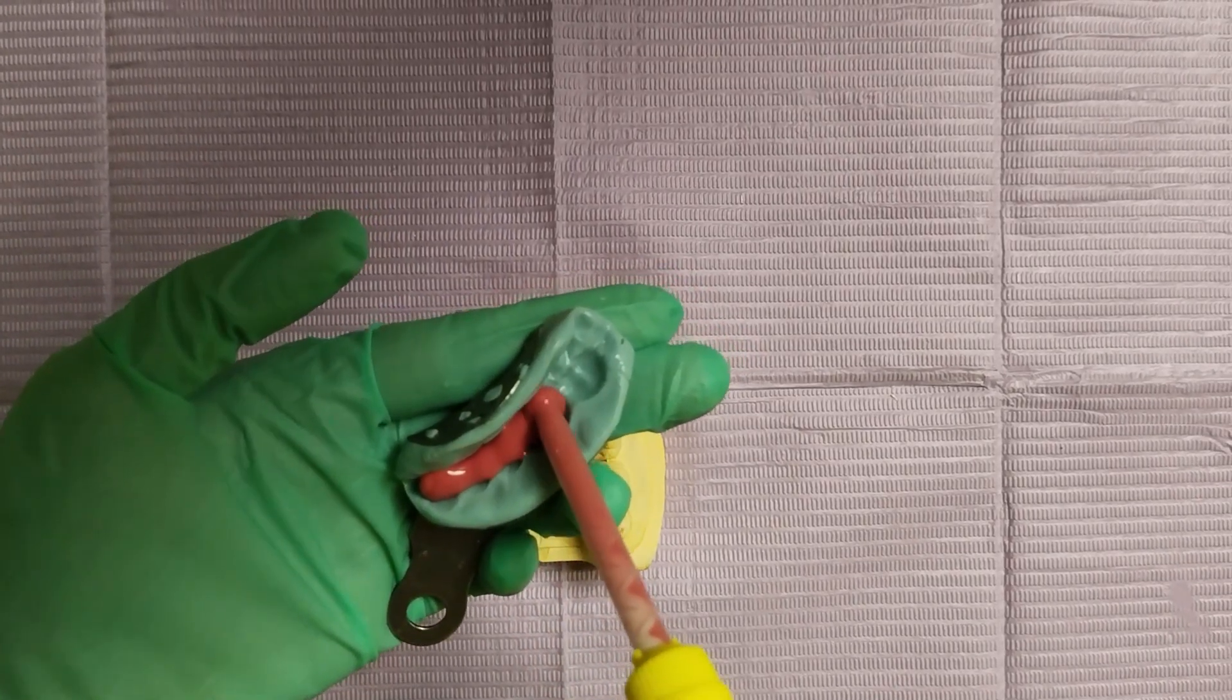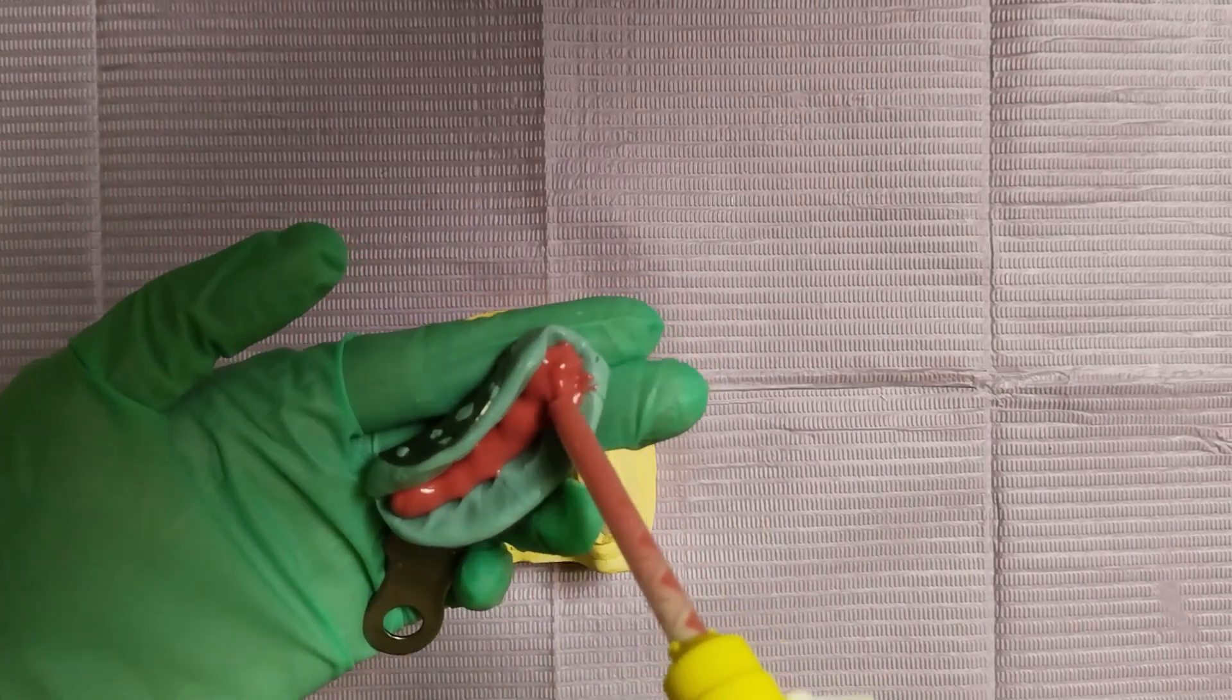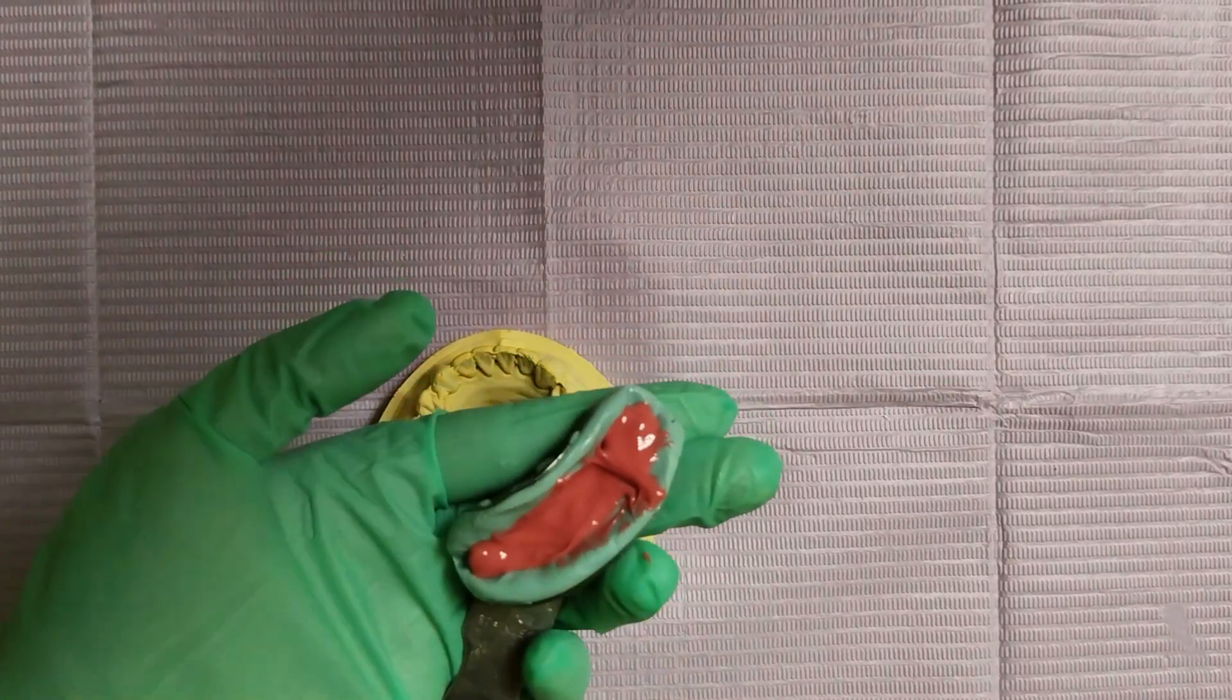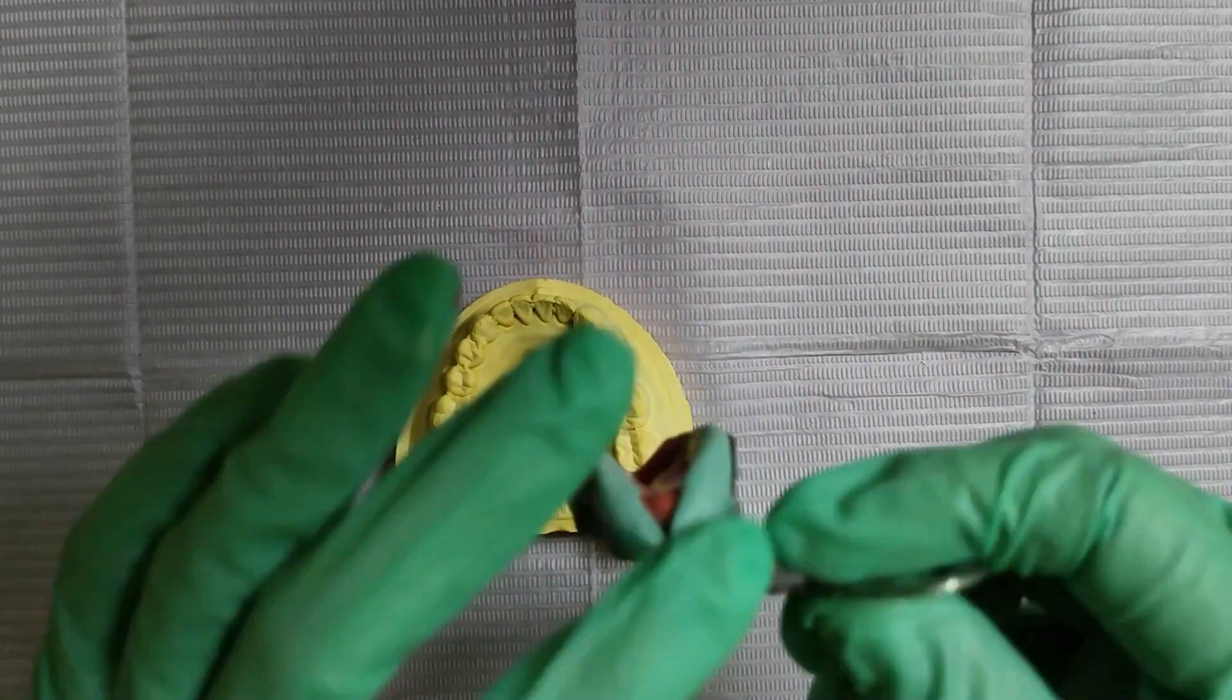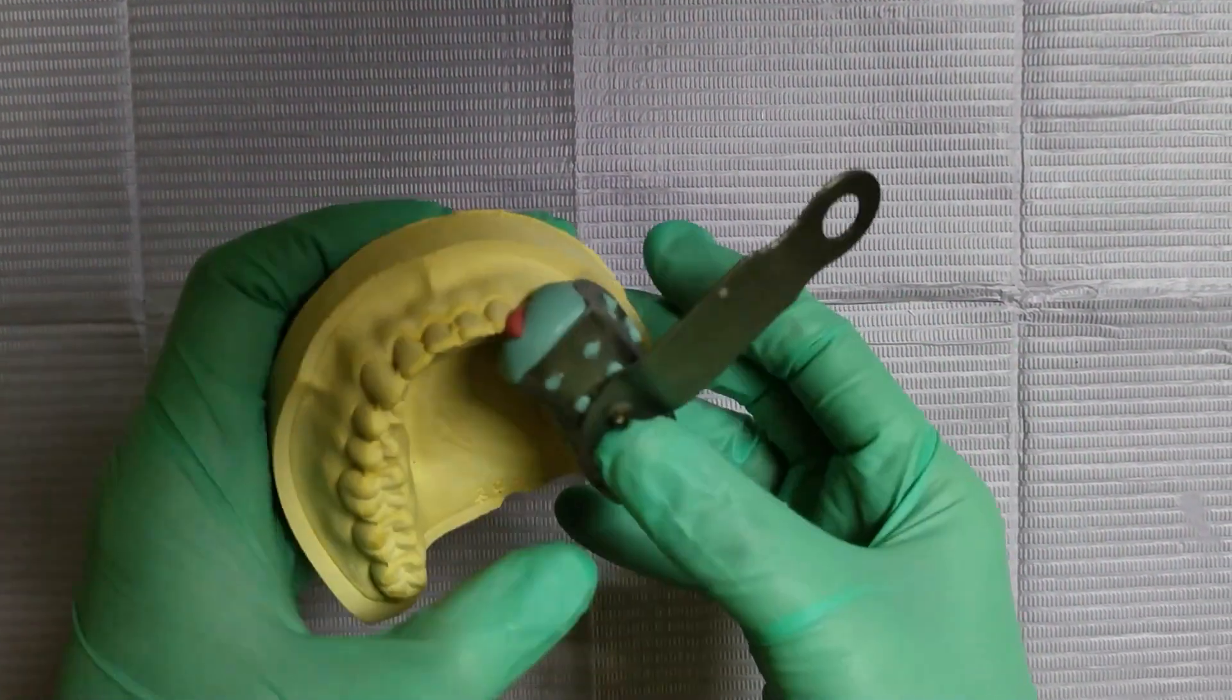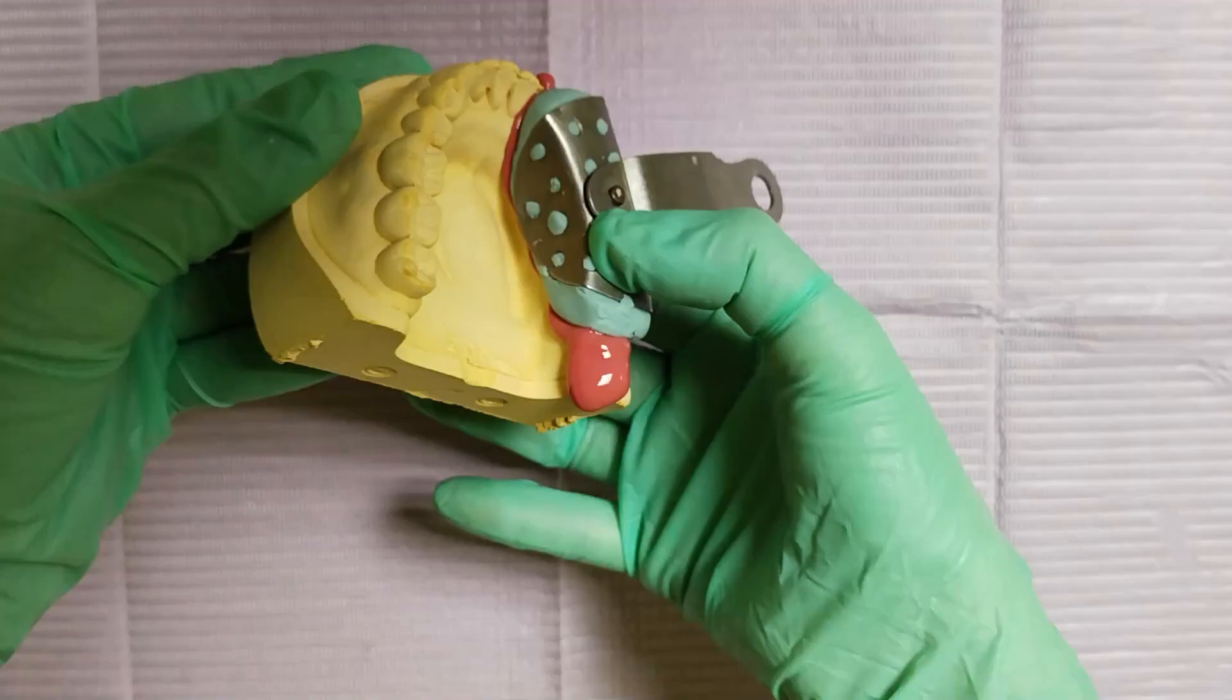Dispense the light body on the tray at the area of your teeth in a slow vibrating motion. You will need a small amount of material to do this. Place the tray back to the model and let it set.